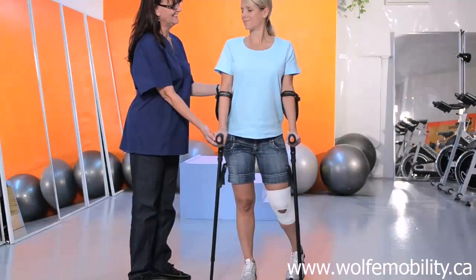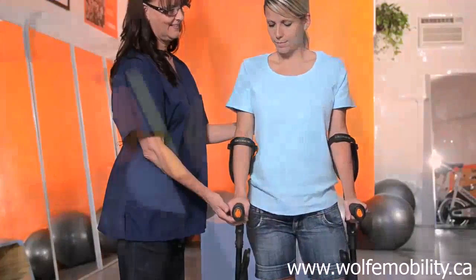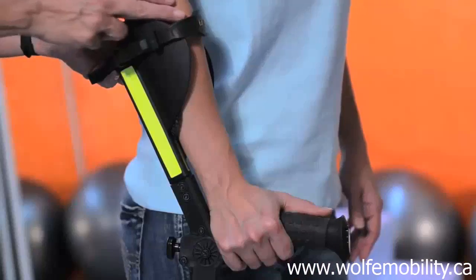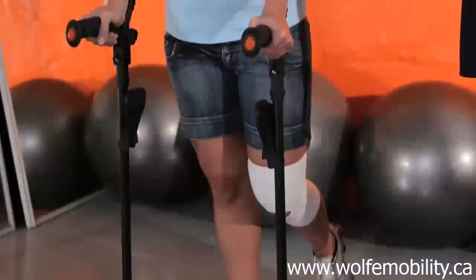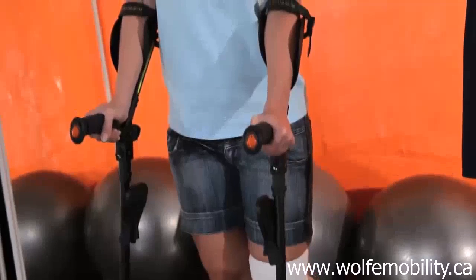To start, stand straight. Crutches should face forward, never on their side. The straps should be placed on the forearms. The two knee rests should be inward, facing the side of the body.